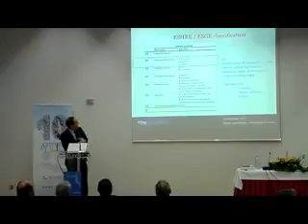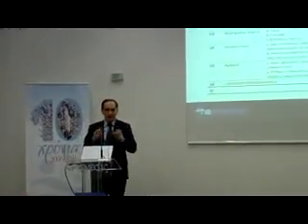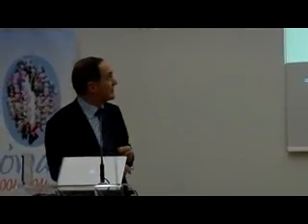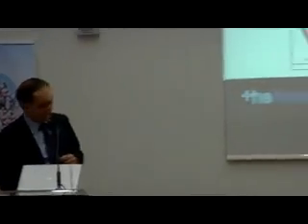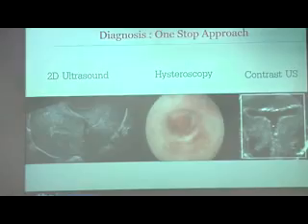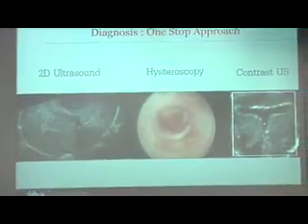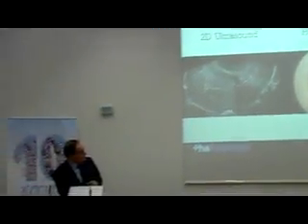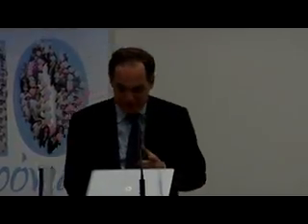And that is this, we go from normal to absence. But these subtle lesions, those little cavity deformations, what does it mean? Does it have any significance? This kind of malformation. Again, you do ultrasound, you see in hysteroscopy, you don't see the tubal ostia, you just see a small way, and then in contrast, in the coronal plane, you see very clearly that the lateral walls are thickened and that we have a problem of a T-shaped uterus.